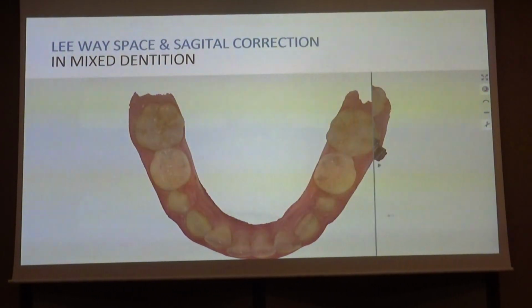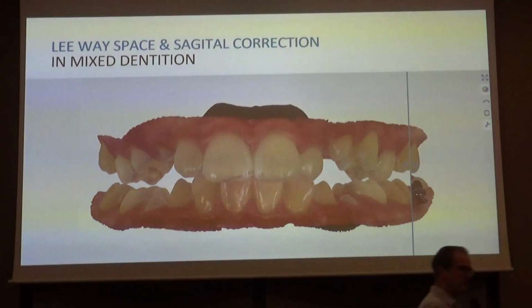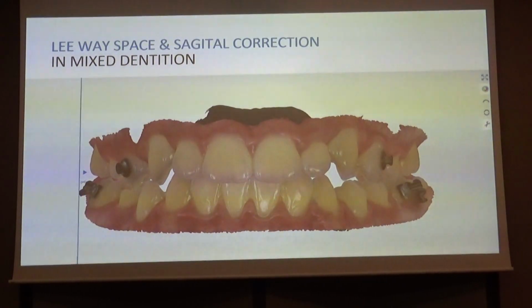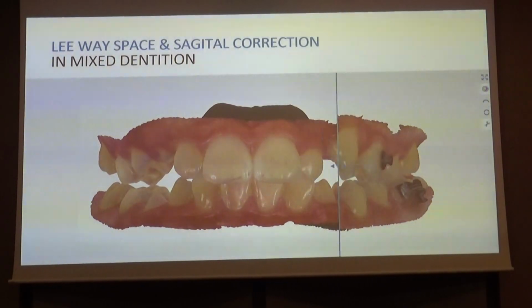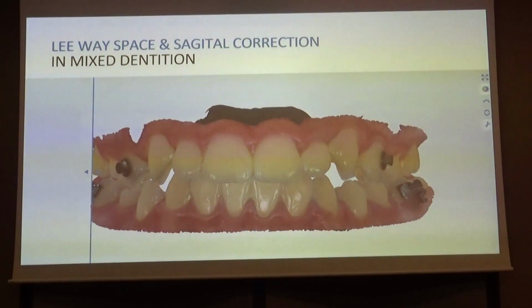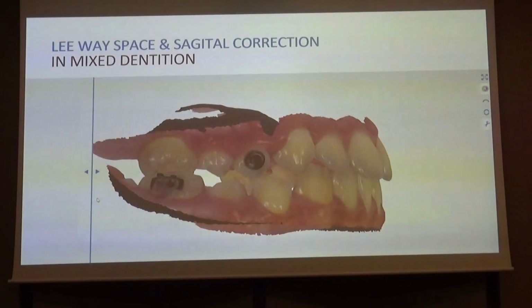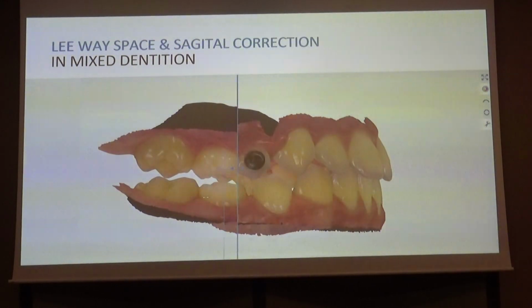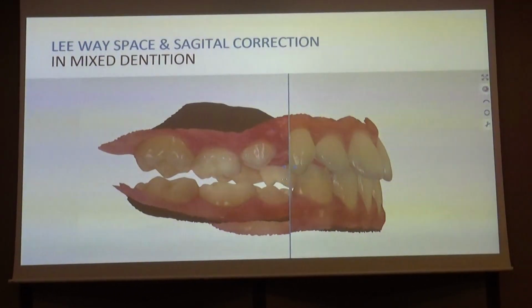tubes in the molars, the lower molars. He's wearing elastics here. And look how we got a better position of the premolar.